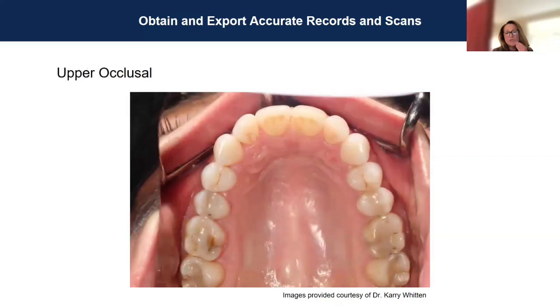And then here's an occlusal shot. That's where the Columbia retractors come in. I have the patient hold it that way, it pulls the lip out, and I have the mirror in. I press the mirror to their lower occlusion. I have the patient tip back and I take it standing behind the patient. I usually have the patient at waist level to do this.